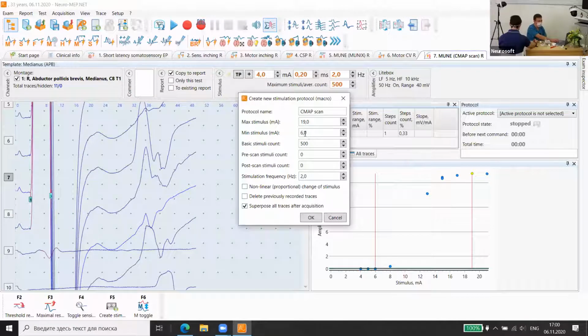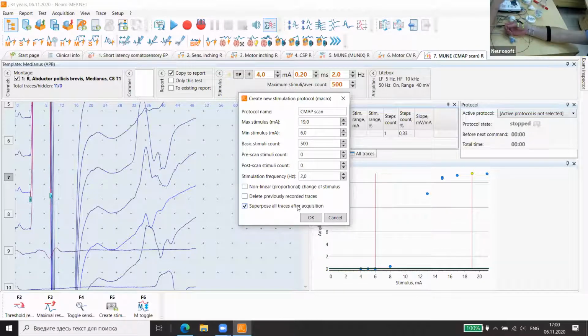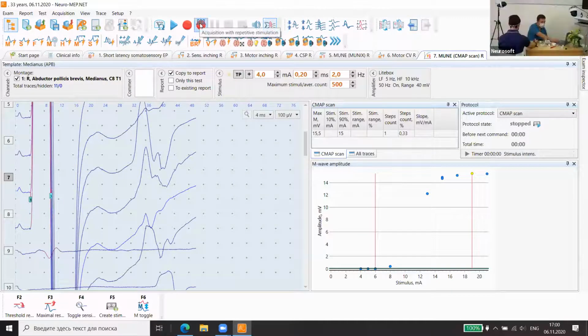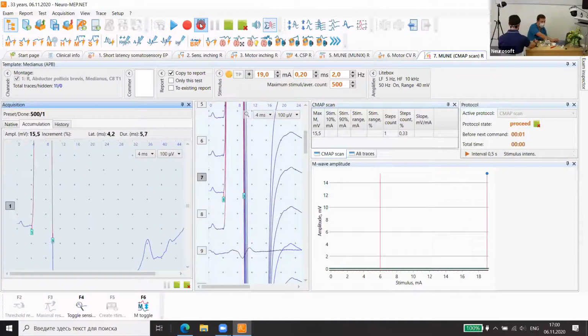So we can see it will be 500 stimulations between this intensity, between 6 and 19 milliamps, with stimulation frequency 2 Hz. Now, as I said, it's better to use adhesive or copper electrodes for stimulation because it's more stable. And we can start stimulation, repetitive stimulation.